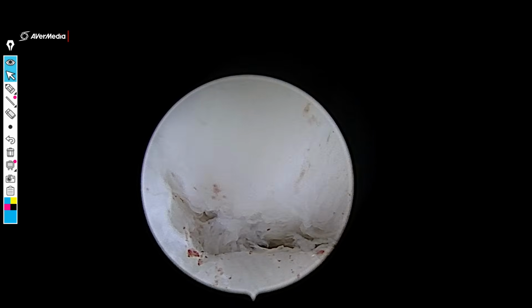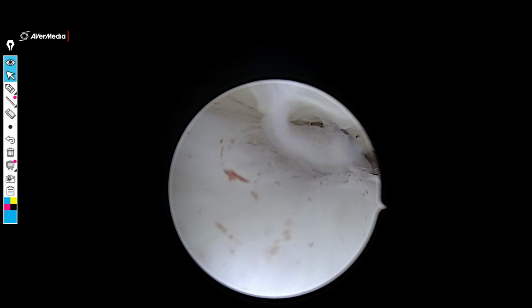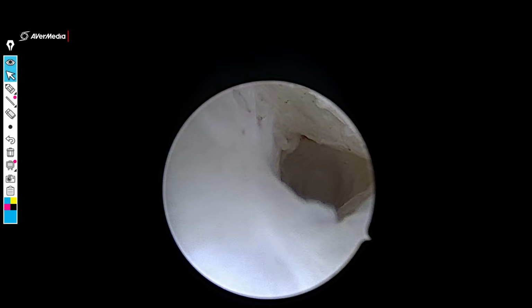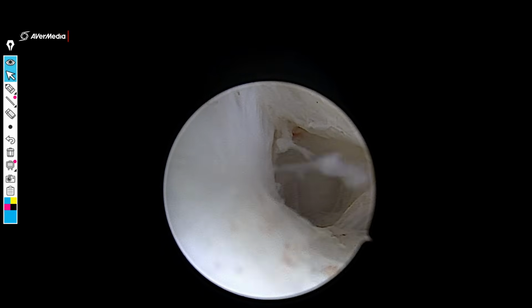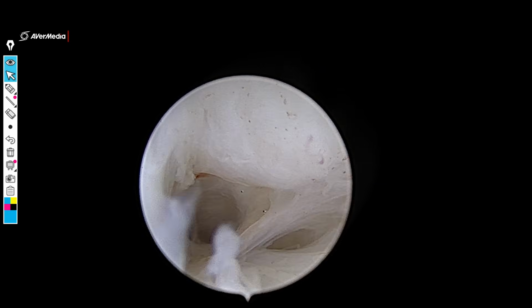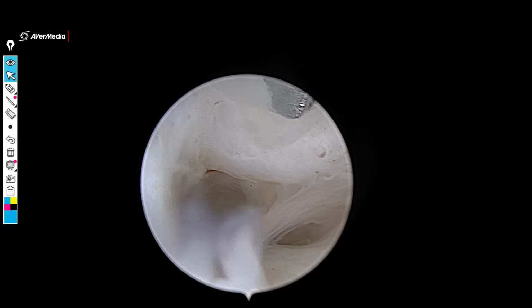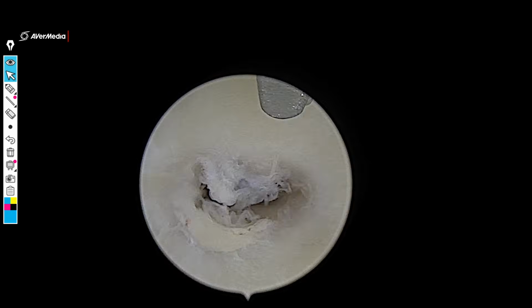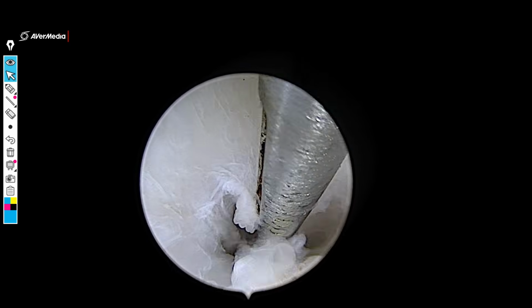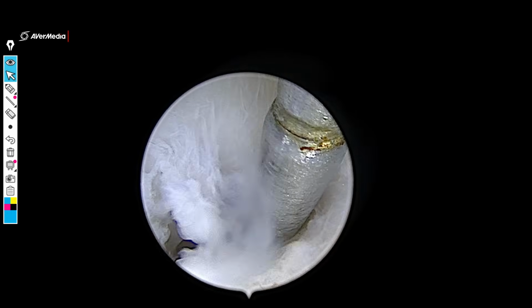So you can see over here, I have not used the scissor at all. I am simply using the 2.9 hysteroscope, and gentle maneuvering of that hysteroscope along with hand movements is sufficient, along with the distending force of saline, to open up the cavity and show me inside. Now here normally you would see a very wide and spacious cavity, but you can see that the cavity is entirely blocked by synechiae.